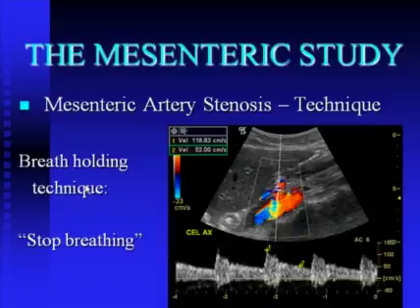So coach the patient through a couple slow, deep breaths, and finally, at the end of a respiratory cycle, just ask the patient for a few seconds to stop breathing. This way, the respiratory motions in the abdominal cavity will cease. You'll be able to get your data. And if a patient just stops breathing rather than actively holding their breath, their abdominal muscles tend to be much more relaxed and you can position the probe much more easily. Nobody gets tired out with this technique.